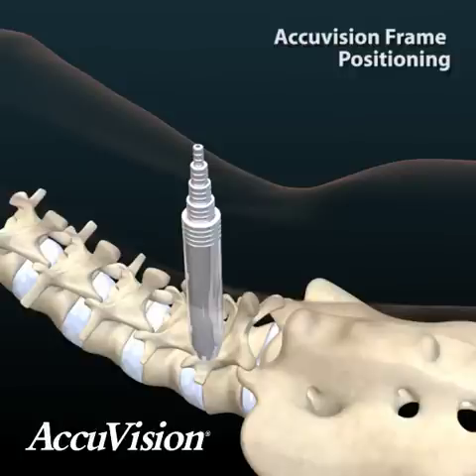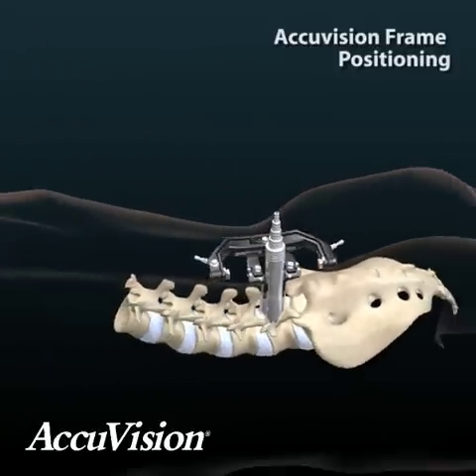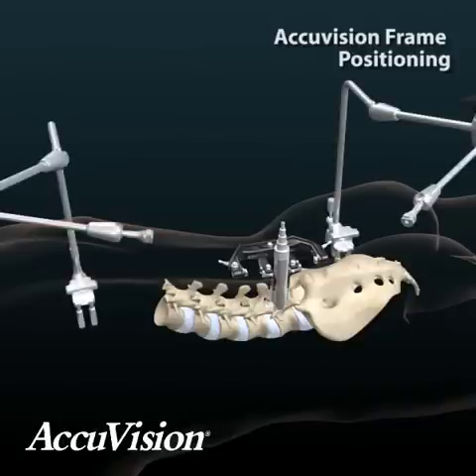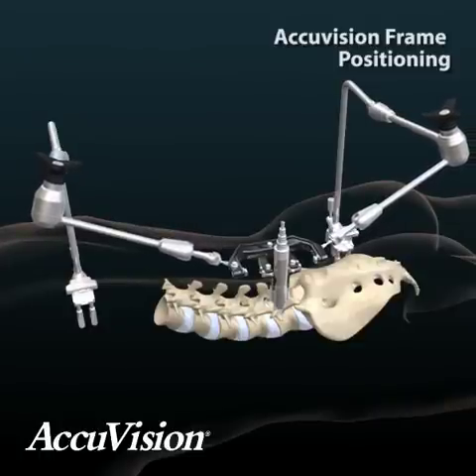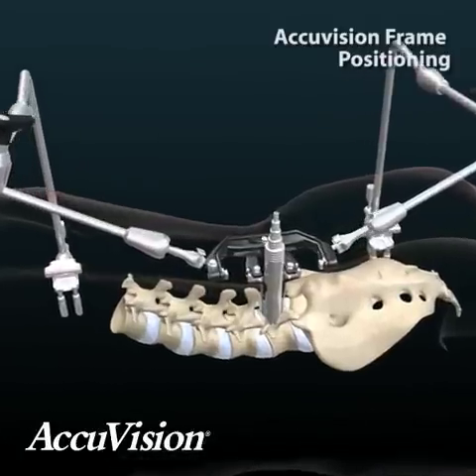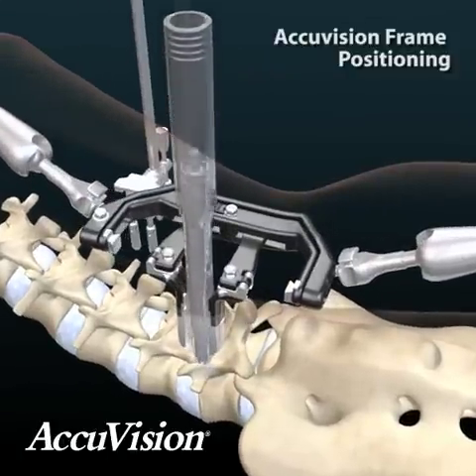With the blades in place, the frame is guided over the sequential dilators and docked onto the spine. Use fluoroscopic imaging to verify position. The frame can be placed with the open side facing medial or lateral to the surgical incision, depending on surgical preference. Upon verification of positioning, the frame is secured into position by attaching the distal ends of the articulating arm to the posts of the frame. The sequential dilators are now removed from the patient.